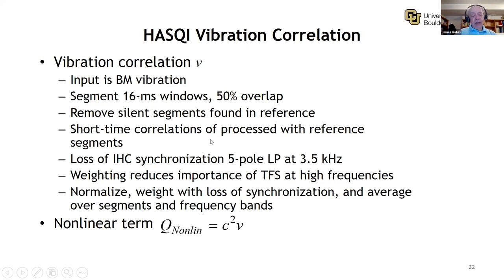The inner hair cell firing tracks pitch periodicity at very low frequencies, but it loses that ability to respond at higher frequencies. So we're modeling that with a low pass filter, and then we sum across time and we sum across filter bands, and that gives us the vibration correlation term denoted by V.